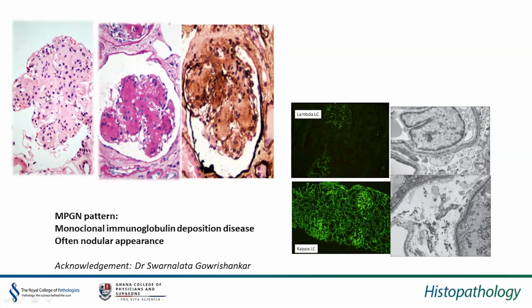And of course, when you're evaluating the mesangial cellularity, move away from the hilum, because in the hilum there's always a little more mesangium, a little more cells. So always look at the more peripheral portions. So here we agree that there is a nodular lobular appearance, mesangial hypercellularity. There is also capillary wall thickening. The mesangial nodularity is intensely PAS positive.